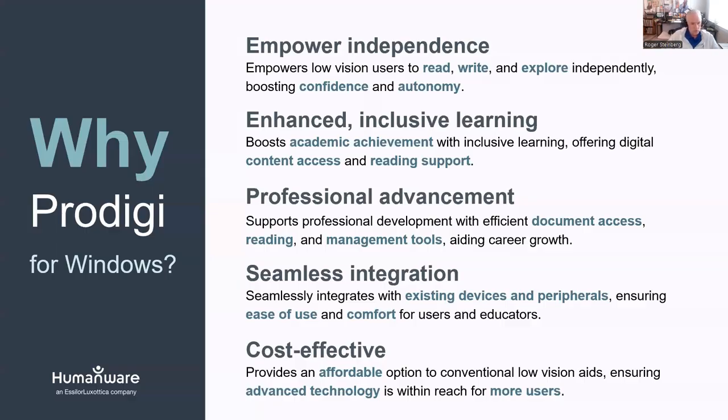It sort of bridges those three age groups from student to someone who's in the workforce to someone who needs it in their personal life. And then again, that VOC, that's the seamless integration and cost effectiveness for use.